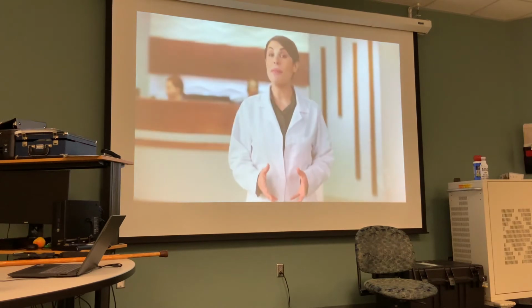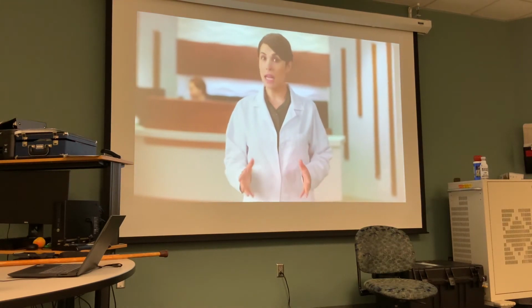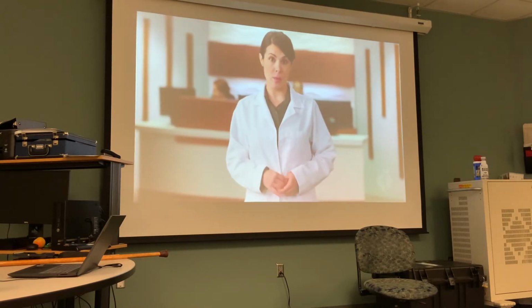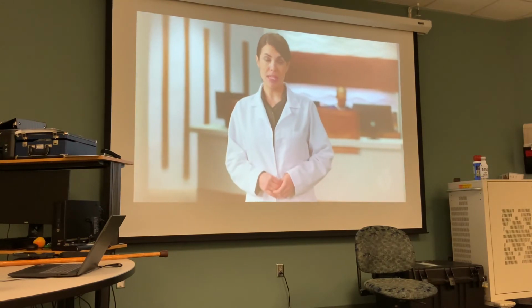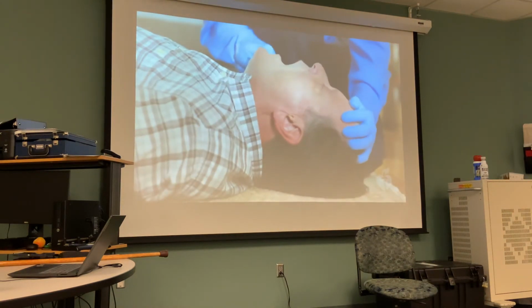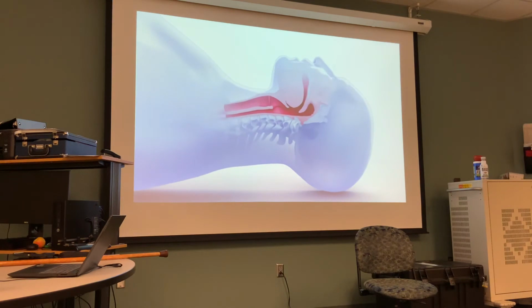Let's begin with basic airway skills. The first two steps in any airway management response involve opening and clearing the airway. First, open the airway by using a head tilt chin lift maneuver. Place one hand on the forehead and one on the chin, and push with your palm on the forehead to tilt the head back while lifting the jaw to bring the chin forward. This simple maneuver lifts the tongue from the back of the throat, opening the airway.